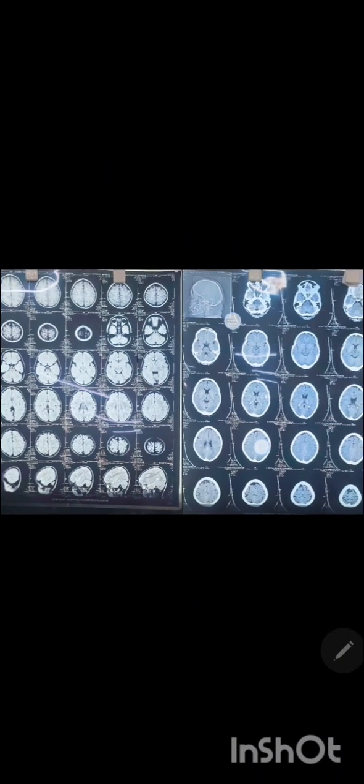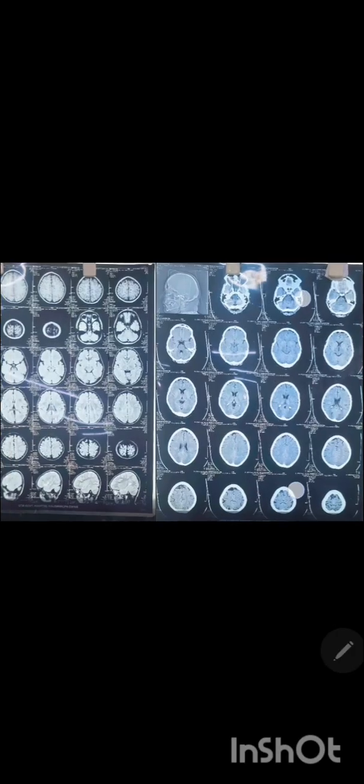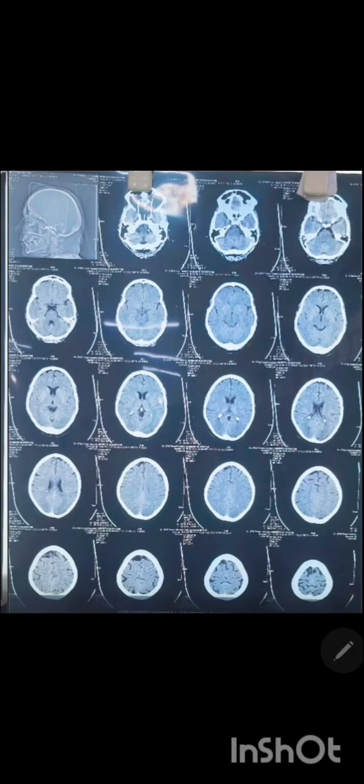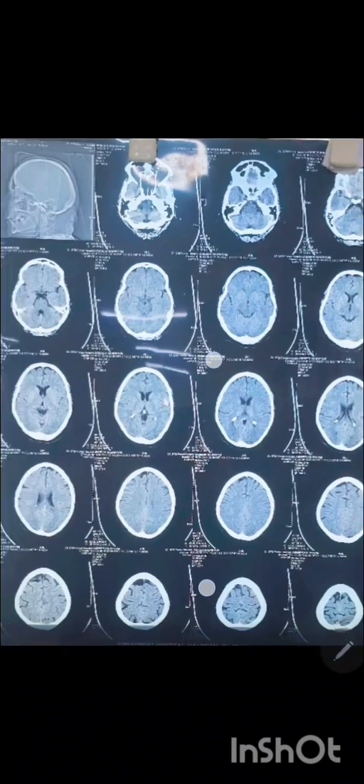For best performance, the CT scan is used to observe structures like bony structures, and if we do the CT scan of other parts of our body, we can check the viscera like the lungs during acute trauma conditions and detect internal bleeding or hemorrhage conditions.